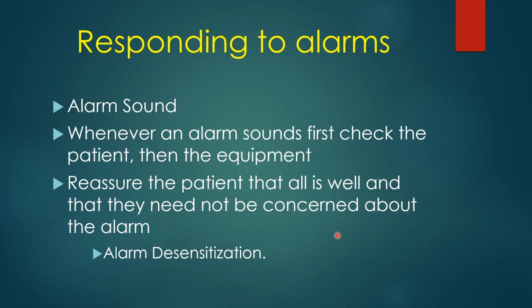Some of our ventilators have alarms that are loud and obnoxious sounding. And some of our ventilator alarms sound like a song somebody's playing or somebody tuning a guitar. They have studied that, and they found that the alarms that are easier to listen to, the more musical sounding alarms, get ignored a lot more than the loud, obnoxious sounding alarms.